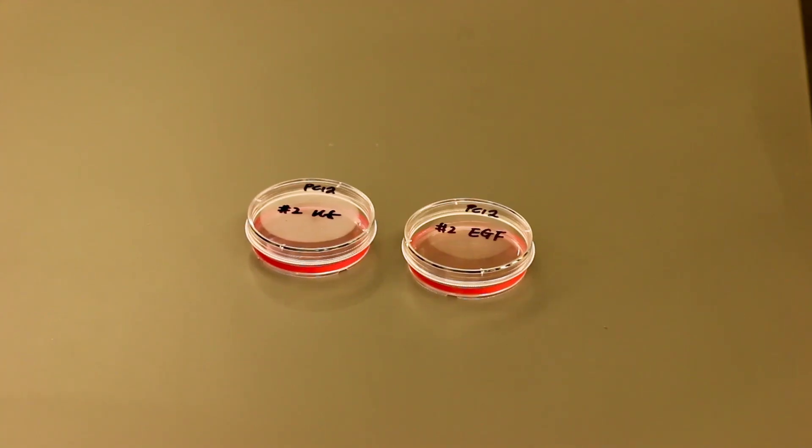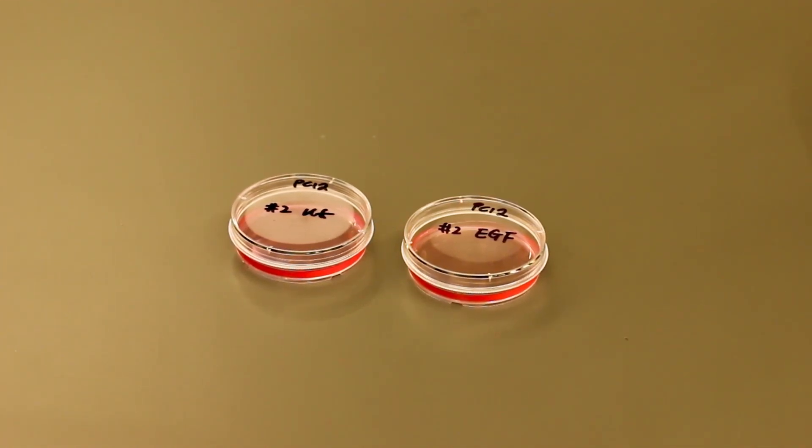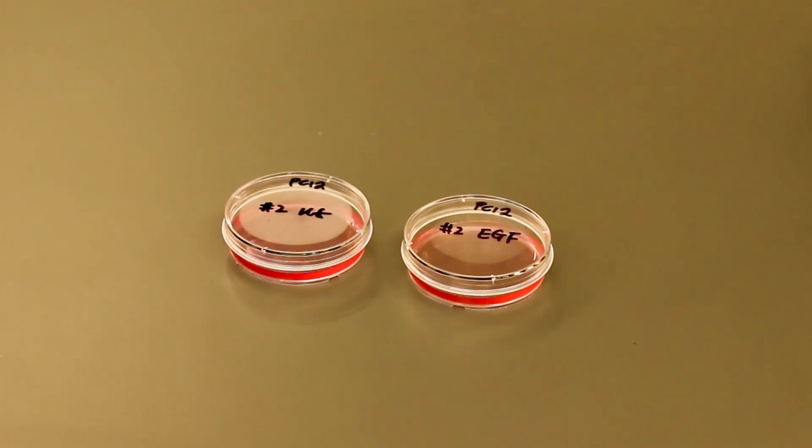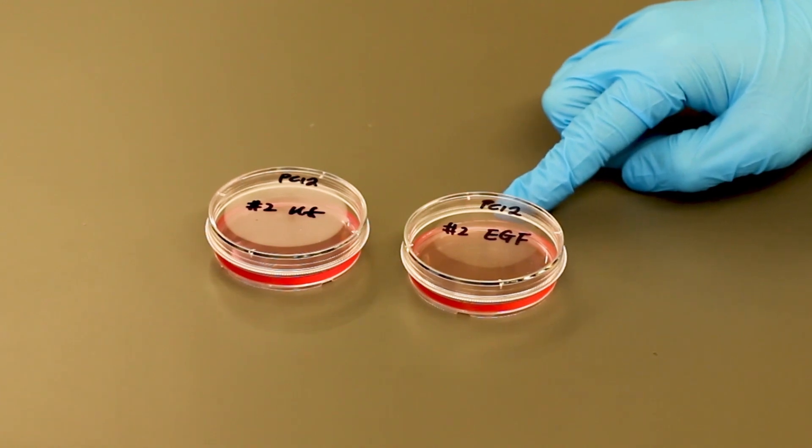Before the treatment, be sure to label on the list of the culture dishes with your table number and sample names, such as UT for untreated and EGF sample.